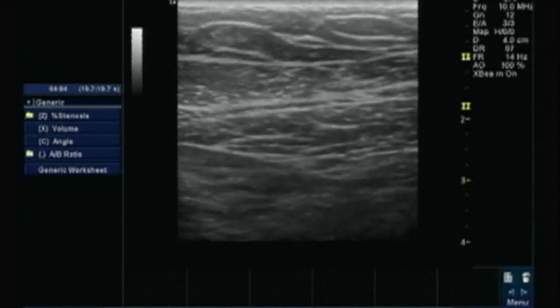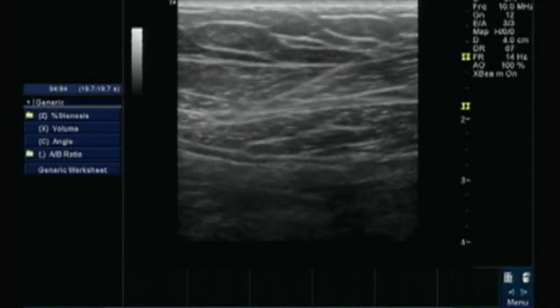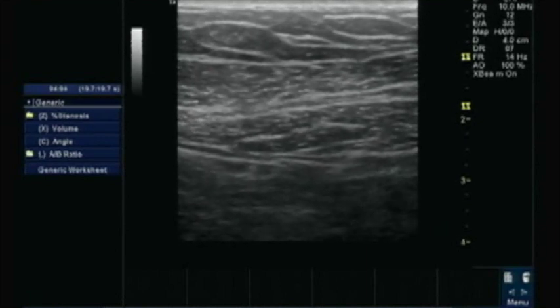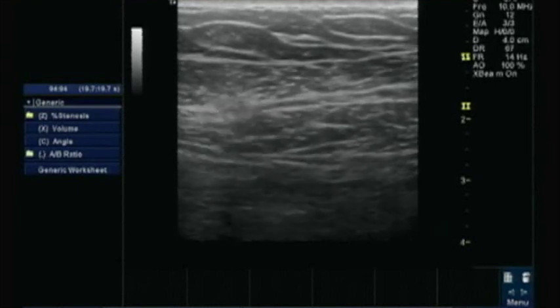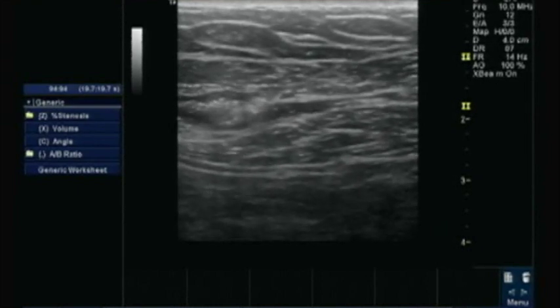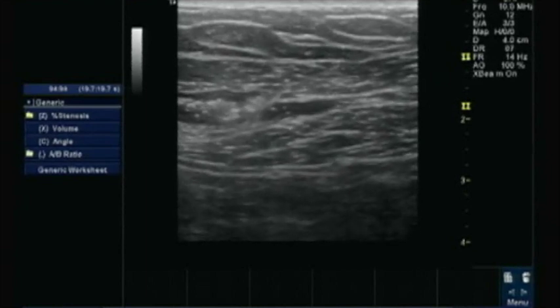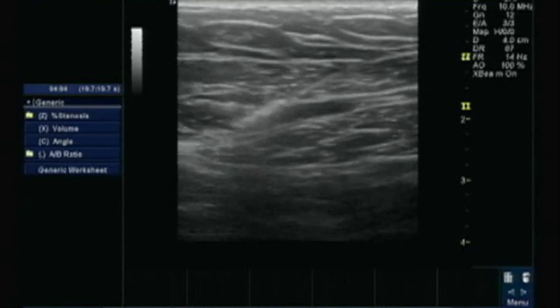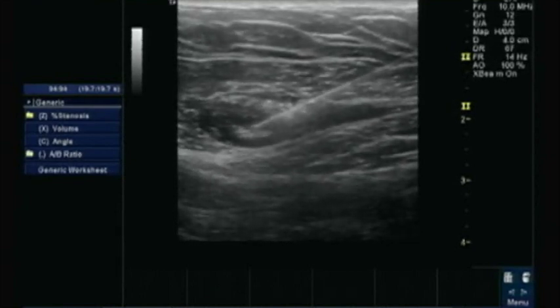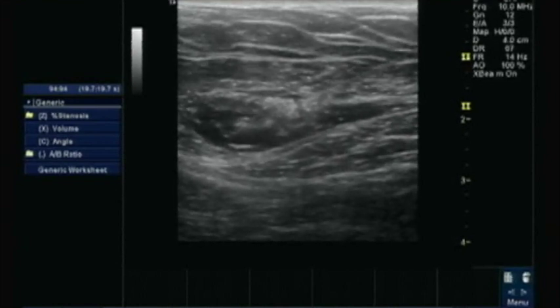So I am targeting the plane between PEC major and PEC minor. Here you can see I have reached almost there. I will inject a small bolus of the drug to see the spread. Now you can see I have injected some drug. I am readjusting the needle to go in the plane, and I will inject 10 ml of 0.25% ropivacaine at this level to block the pectoral nerve.